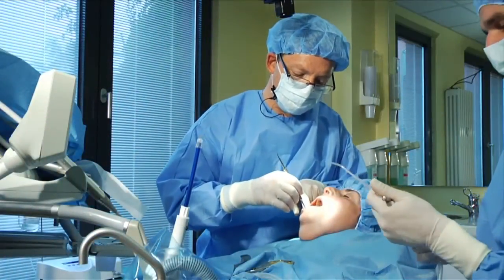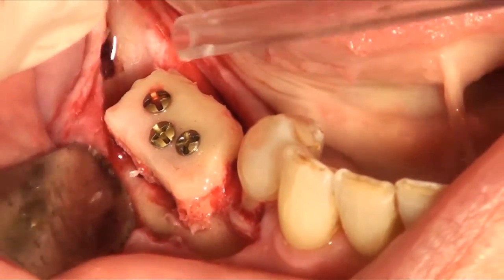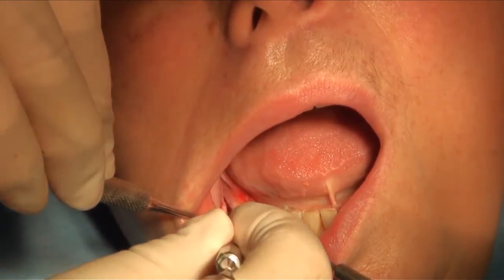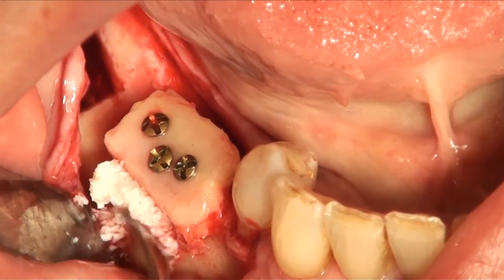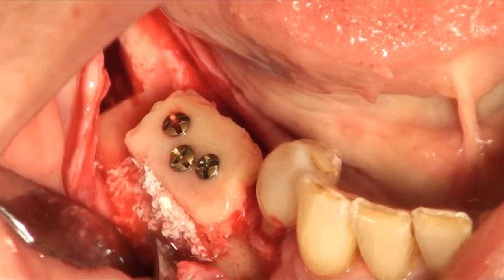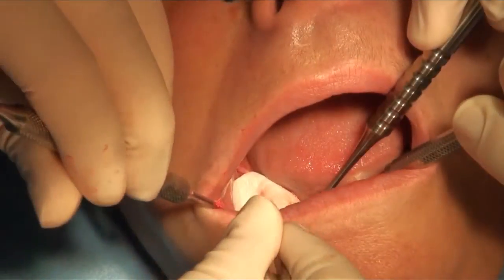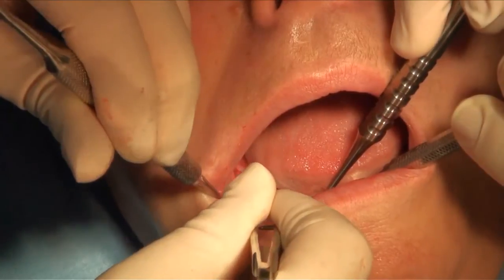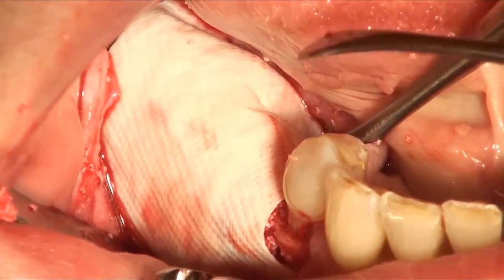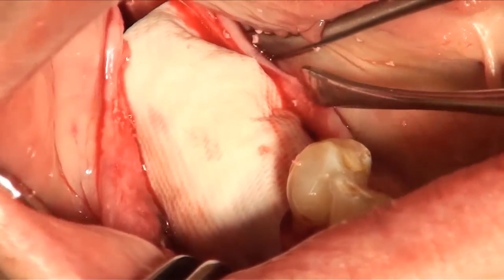Now we fixed the bone block with 3 fixation screws. It is absolutely stable, and it is really very precisely in space. We will add some bio-oss material, some deproteinized bovine bone mineral. So here we go. Now we apply the cross-linked collagen material. That's how it looks after the membrane is in place. It doesn't need any additional fixation. It will be fixed by the flap.